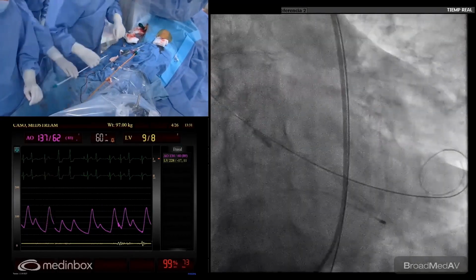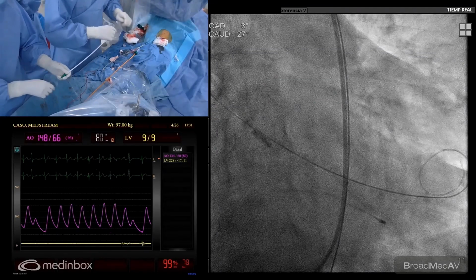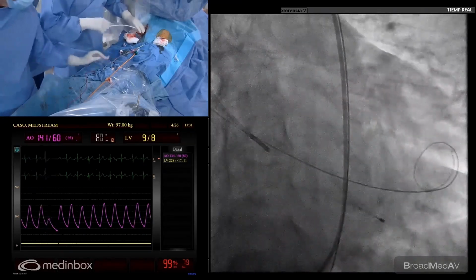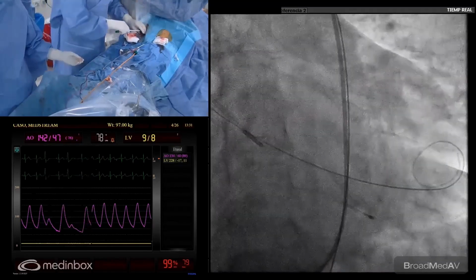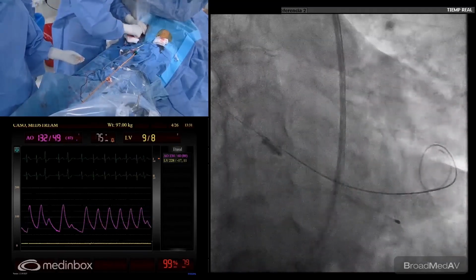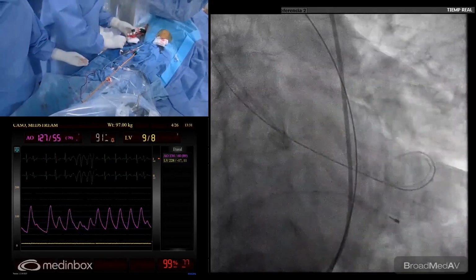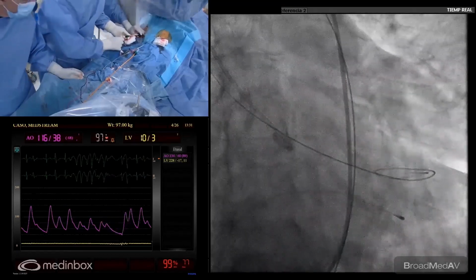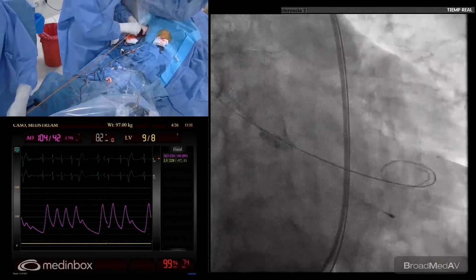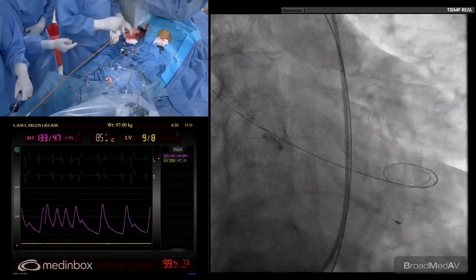Some people don't expand the dilator with the 18, as we were talking about yesterday with a group. But we always increase the size of the introducer with the 18, so the valve can navigate more easily. Give me the sheath, Franco. Okay, Fernando. So let's go here. We will check the valve before going out of the introducer.